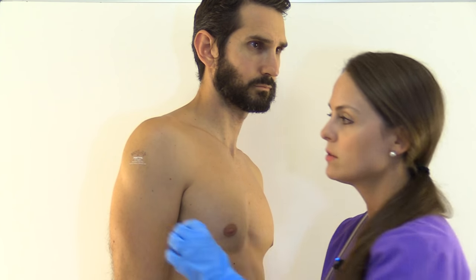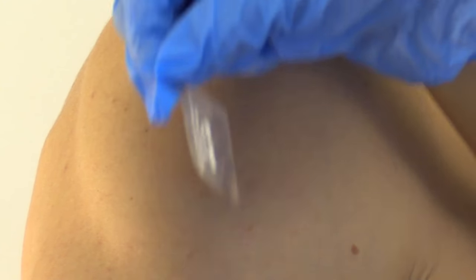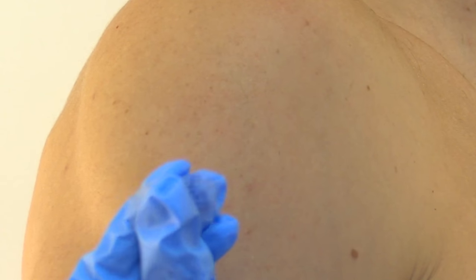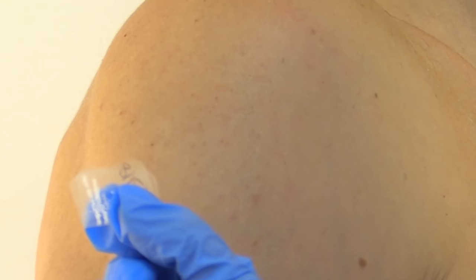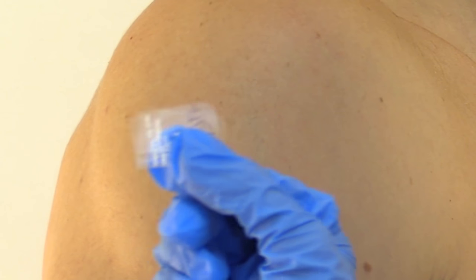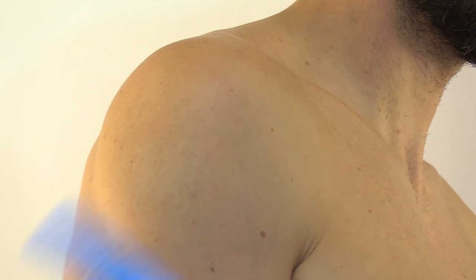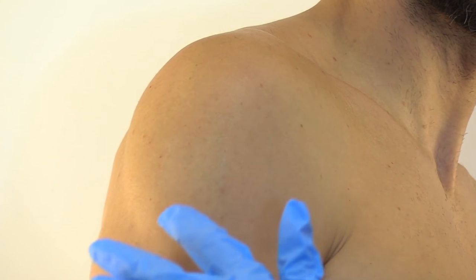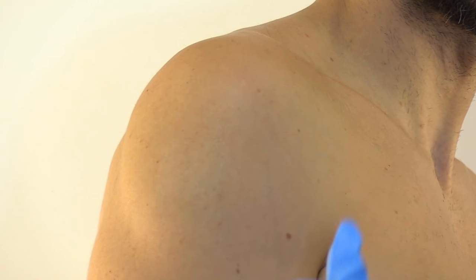Gently remove the patch, then fold it together sticky side to sticky side like this, and dispose according to your hospital's protocol. Because this is a narcotic, you're going to need another nurse to witness you disposing of it according to your institution's policy. After you dispose of it, you can clean the site with soap and water if it's left any residue, since lint and old dead cells can collect around the site.